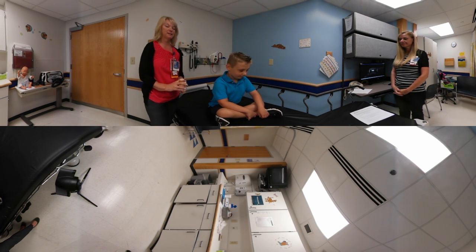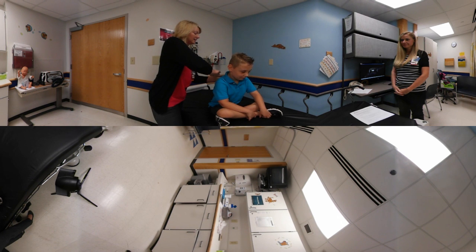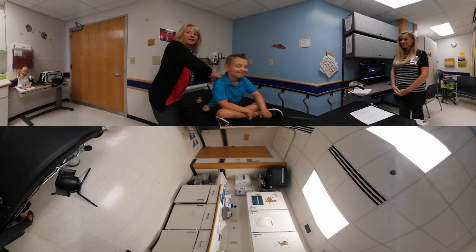So now we're going to talk a little bit about CPT. With CPT, you can either use handheld percussors, and you can also use your hands — a cupped hand. Either one gets the job done.